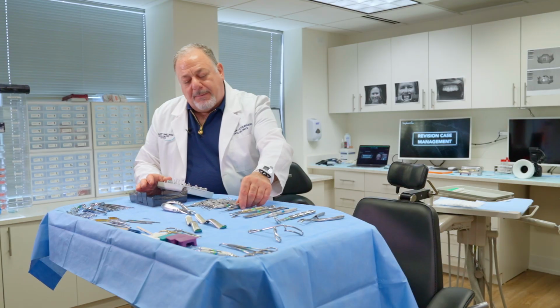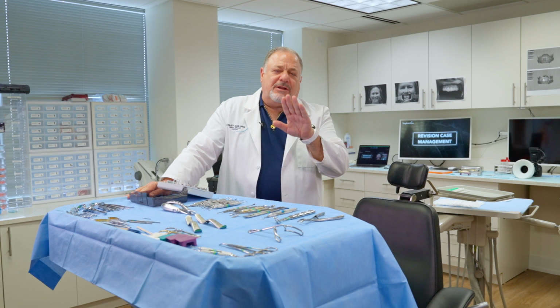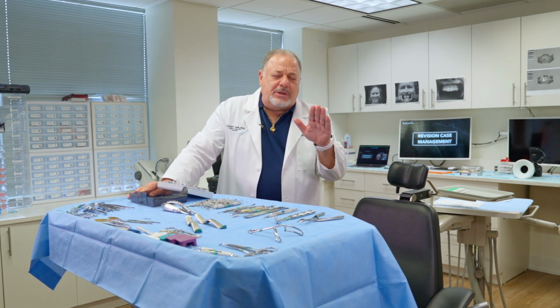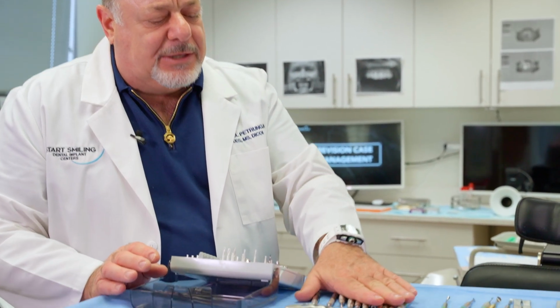They're kind of modified Gar elevators with compression ends at the end of the elevators. But also now, as we get into the aesthetic zone, we really want to try to stay away from an incision if we can, and create more of a tunnel type of situation, back into a periodontal grafting type of procedure, to be able to bulk up the volume of tissue and also coronally reposition the tissue down. So we have quite a bit of instruments here.